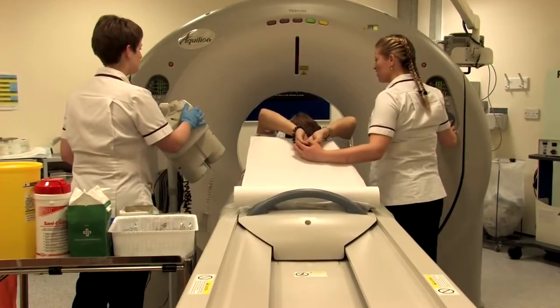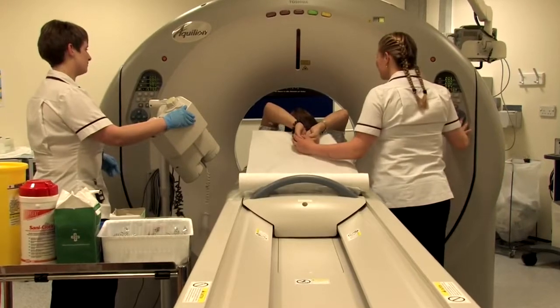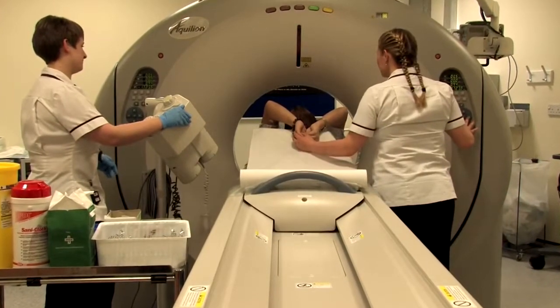You'll have a CAT scan done of your vessels before the TAVR is performed to make sure that we minimize those risks. In addition, there's a slightly higher risk of needing a pacemaker after TAVR than you would expect after surgical aortic valve replacement. This can range from 4 to 12% of patients.